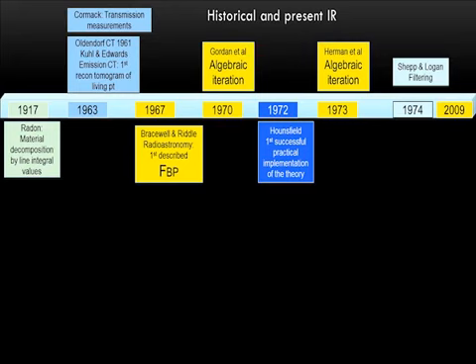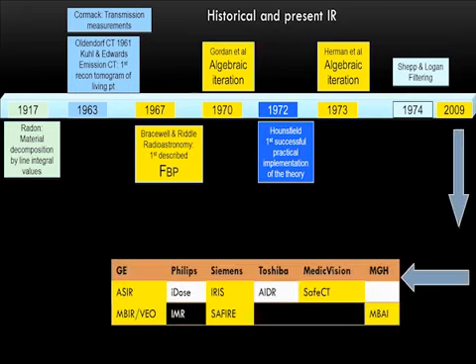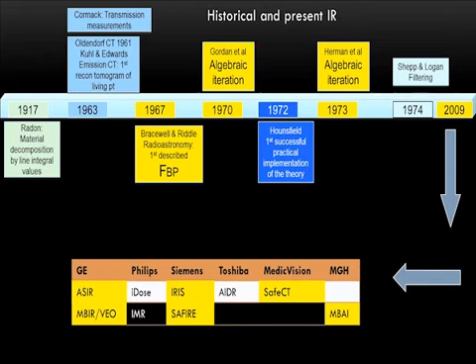And then in the 1970s, Gordon introduced the algebraic reconstruction technique, which was used in the first EMI scanner. But filtered back projection, or FBP, was used for CT imaging because we had good enough signal, and for emission tomography we had low signal, and that's where IR was developed and refined in the 1980s. To the best of my knowledge, somewhere around the early 2000s, when we were trying to lower our doses, we ran into this domain of low signal in CT, and computational power was coming up with faster GPUs and PCs, and that's where we rediscovered IR and it came back to the CT domain.